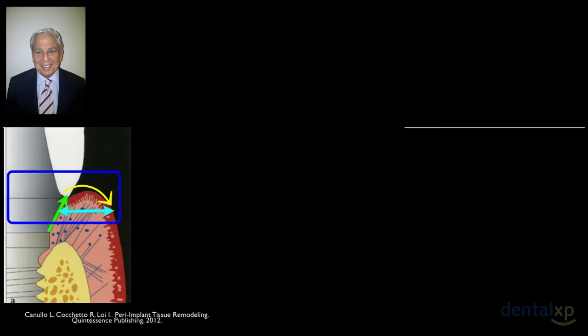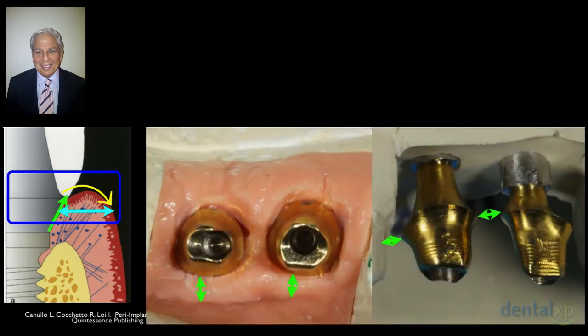Now, that is okay. This type of abutment design is great. This is what we've been using for years. This is what we try to achieve in ideal crown and bridge preparations. But it's good only if we have enough space to utilize this. Remember, we're dealing with a limited amount of space, so if we're taking up too much space with one component, we're going to have less for the other component.